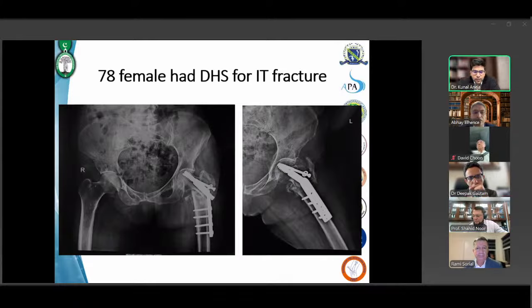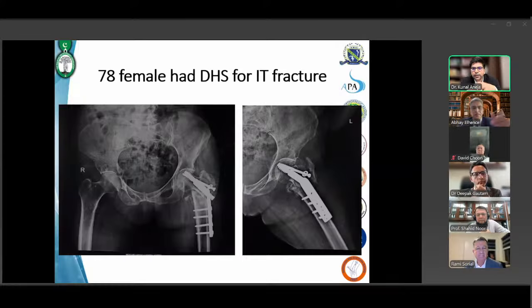So this is a failed osteosynthesis of an intertrochanteric fracture which has not been reduced well, and the DHS has failed, and there is a loss of the abductor mechanism also. The GT has escaped. This would definitely need removal of the implants and a distal fitting stem. So I would like to go further down beyond the screws for fixation of the stem. And there are high chances of dislocation in females with post-traumatic cases. So I'd like to have a dual mobility cup on the acetabular side. To capture the GT fragment, I might use a plate on top of it as a hook plate for fixing the GT and capturing the abductor mechanism along with it.